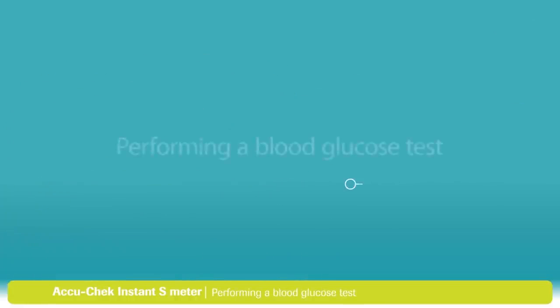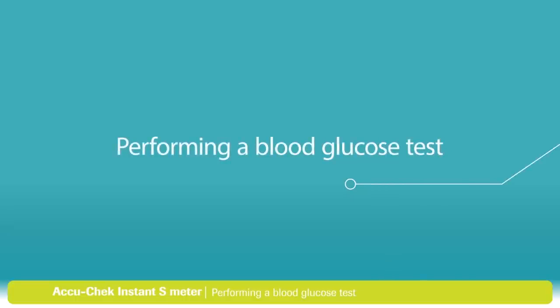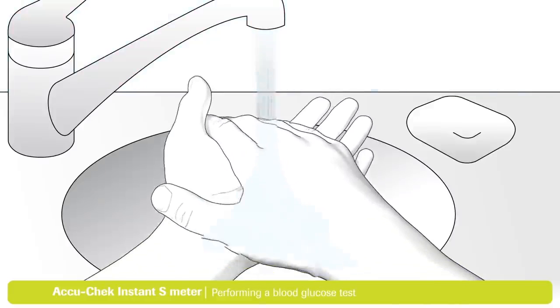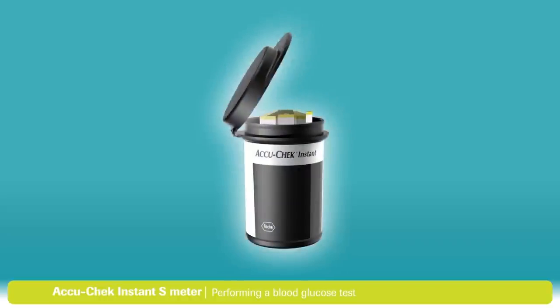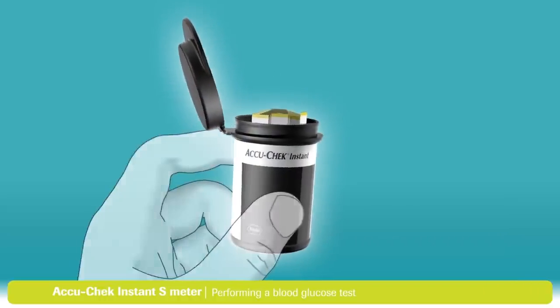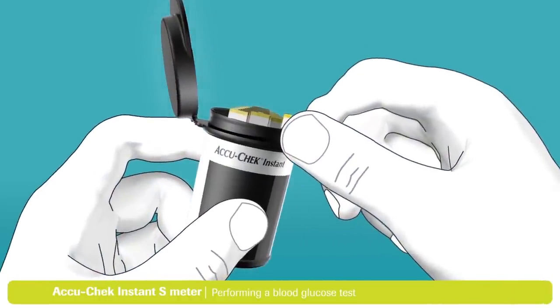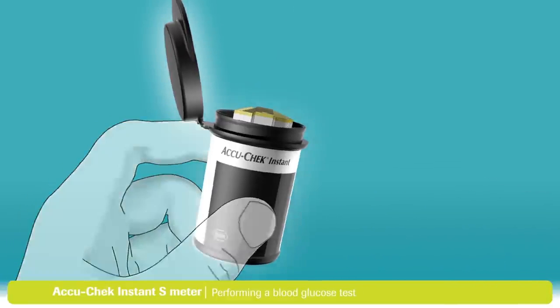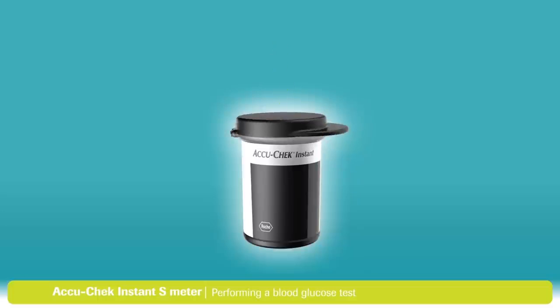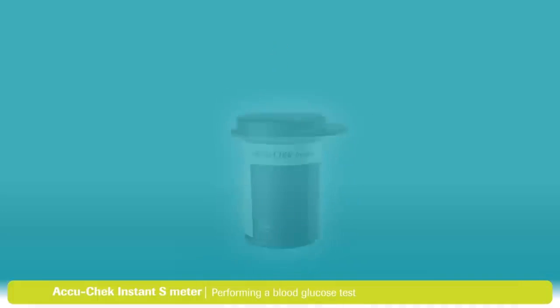Now you're ready to do a test. First, you'll need to choose a finger to take a sample from. It's best to alternate between fingers as they can become sensitive over time. Remember to always wash your hands with warm soapy water and dry them thoroughly before you test. Remove a test strip from the test strip container, and always remember to close the lid tightly. This helps protect the remaining strips.